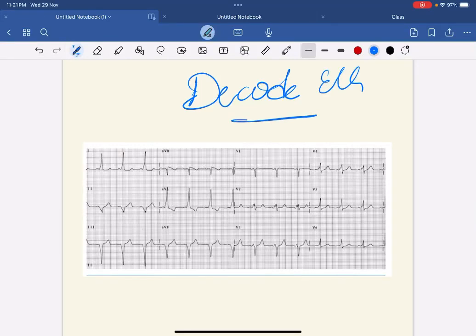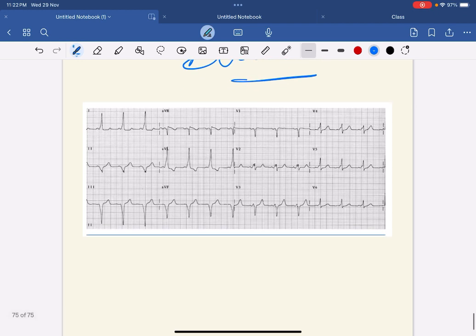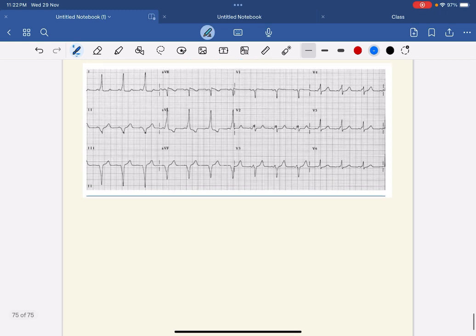Hello friends, welcome to another episode of Decode ECG. Assuming that this ECG is taken with normal standardization, let's calculate the rhythm. For that you have to see lead 2.